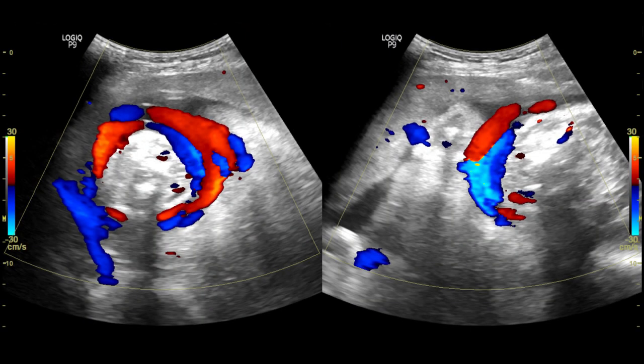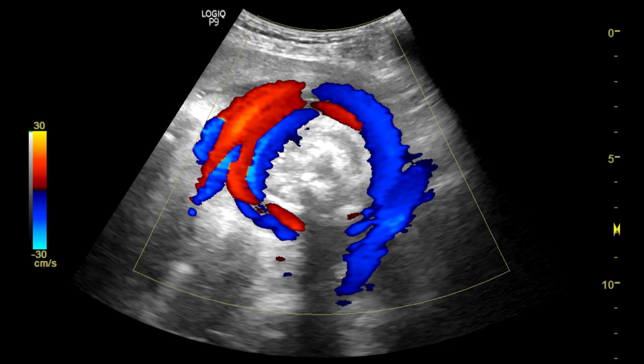In this picture, you can see the transverse and longitudinal sections of the fetal neck. Multiple layers of cord are seen around the fetal neck on Doppler. This cross-section of the neck with Doppler can demonstrate the number of umbilical cord layers. It's easy to count the number of veins rather than arteries to have an accurate idea. Here we can see three umbilical veins on Doppler, indicating three layers of cord around the fetal neck, which is creating a problem.